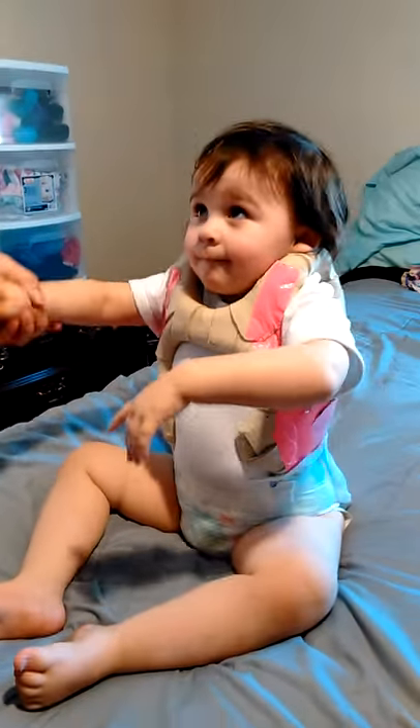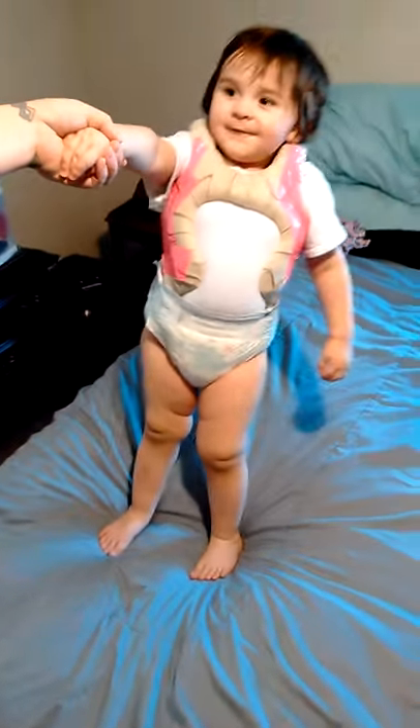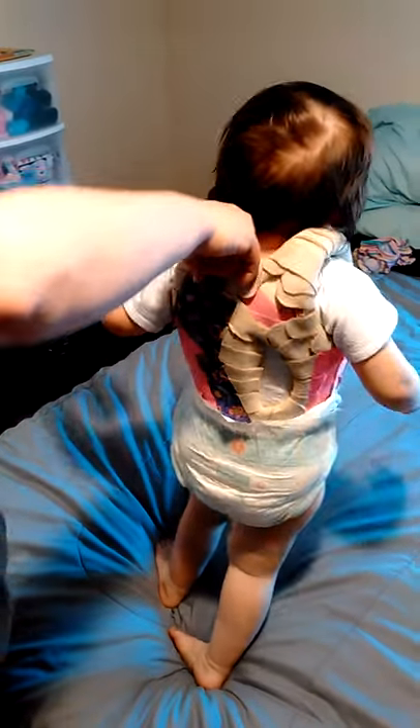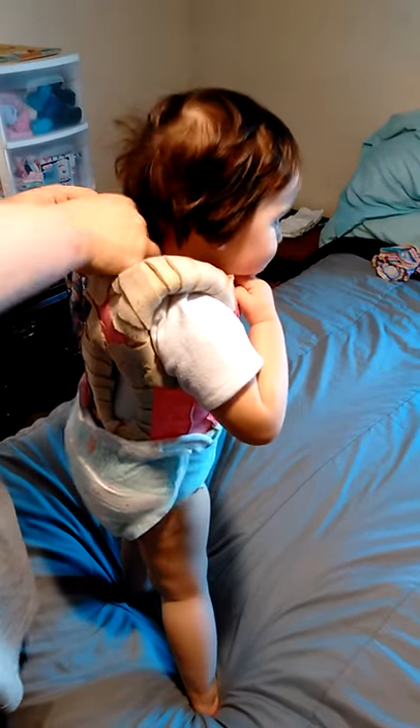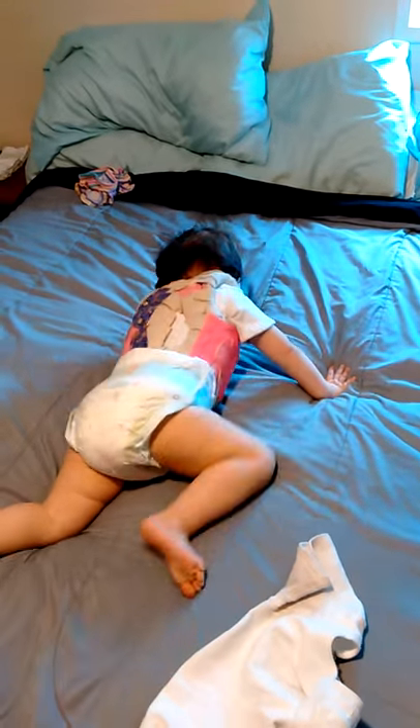So there she is — Judith, she is a year and eight months. That's how you do it. We'll do a little video on how to do some pedals here pretty soon too, just to help anybody that's really worried or confused about it. It's not that bad.